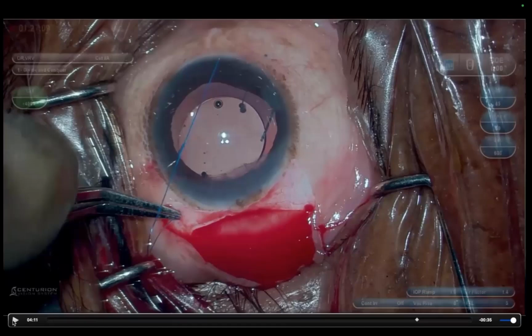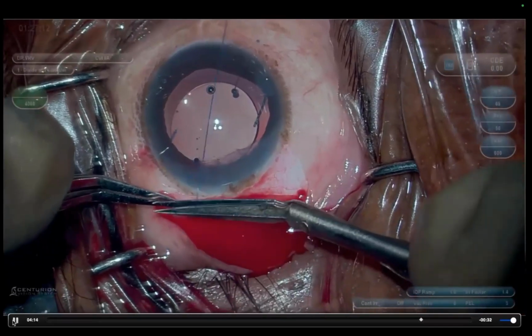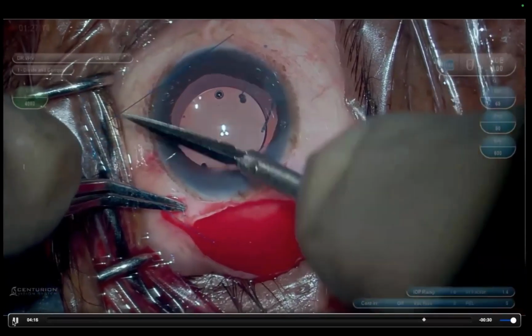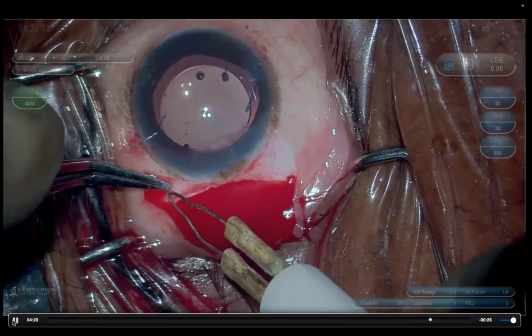So now, before flanging the second site, make sure that you form the anterior chamber very firmly. So now you cannot pull, because if you pull, the flange might break. So instead, you indent the sclera slightly, and then you create the flange.